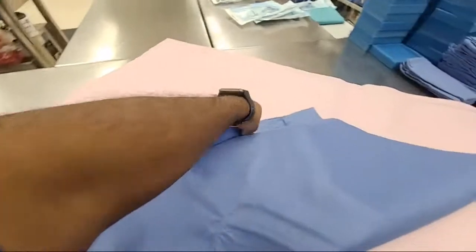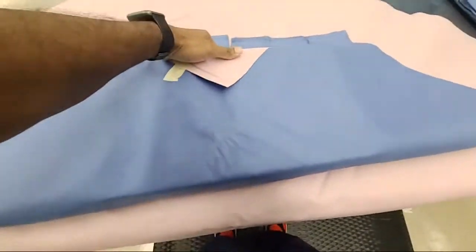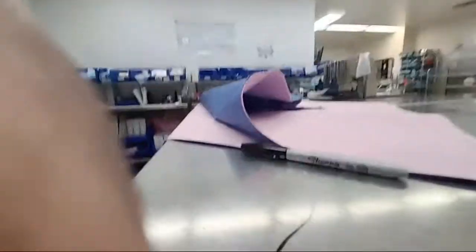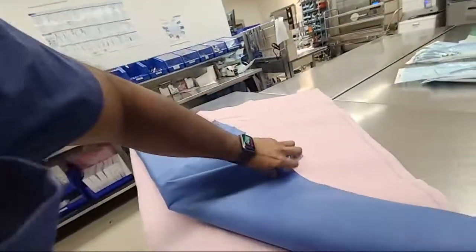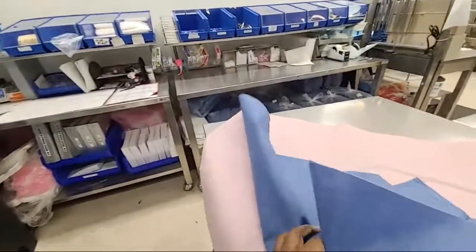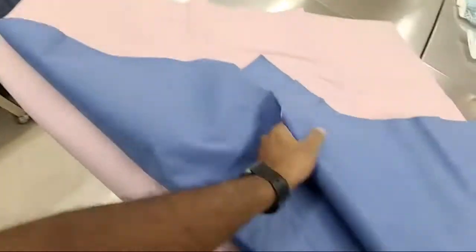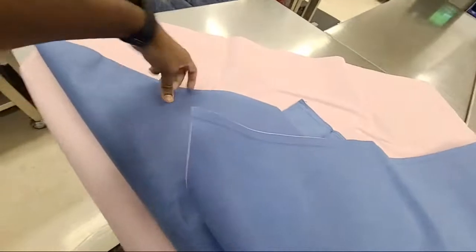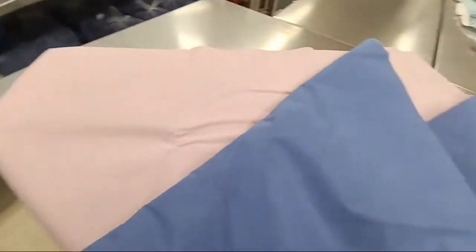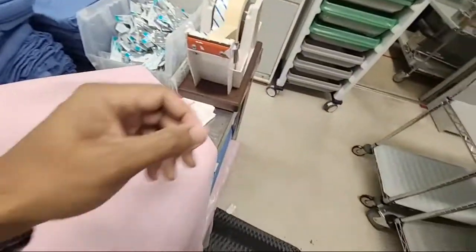So you have to kind of work backwards and realize how this is going to be unwrapped. So we're going to make it nice and tight on that side. Oh, this is going to be a challenge. Let's see. Can we get an angle like this? No, you're not going to be able to see it. Alright. So we'll tuck that corner in. We'll wrap it on over. Oh, this is actually not too bad. Surprising myself. That side, and then we tuck this side in. If you've ever wrapped a present for someone on their birthday or for Christmas, then you kind of understand how to do this already. So now we want to get one more piece. And the part we're going to put together is the two pieces we folded over.